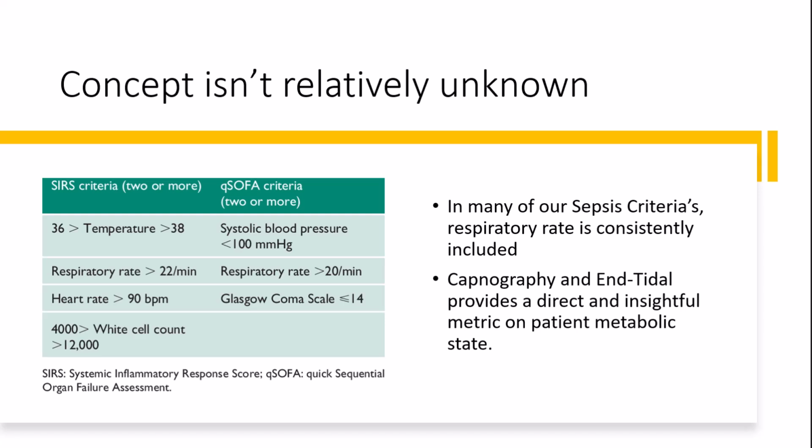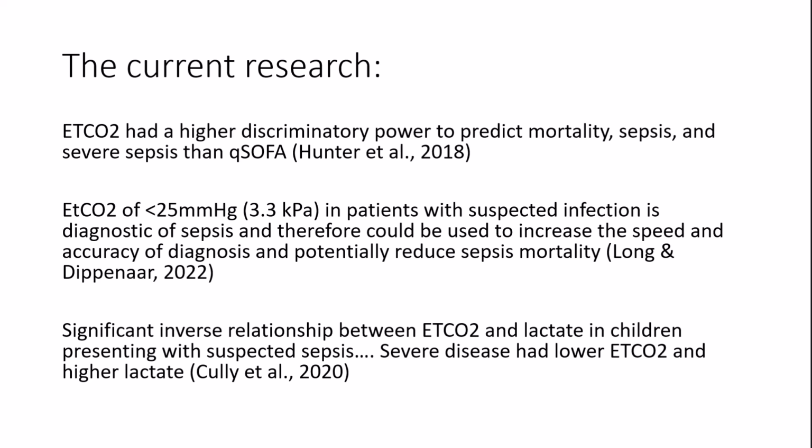Now, this concept isn't unknown. I mentioned here in the SIRS criteria and the qSOFA criteria that respiratory rate, and I guess only respiratory rate really, is included in both the SIRS and qSOFA criteria. So end-tidal capnography really allows us to quickly identify in an objective way that the respiratory rate is indeed above the normal threshold, or is meeting that threshold for potential sepsis. So this is the current research around end-tidal and using it as maybe a helpful marker in sepsis.